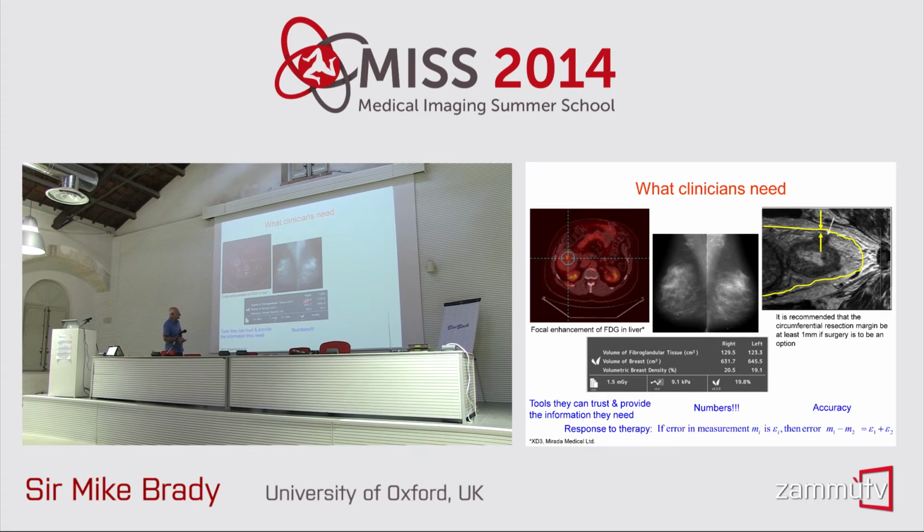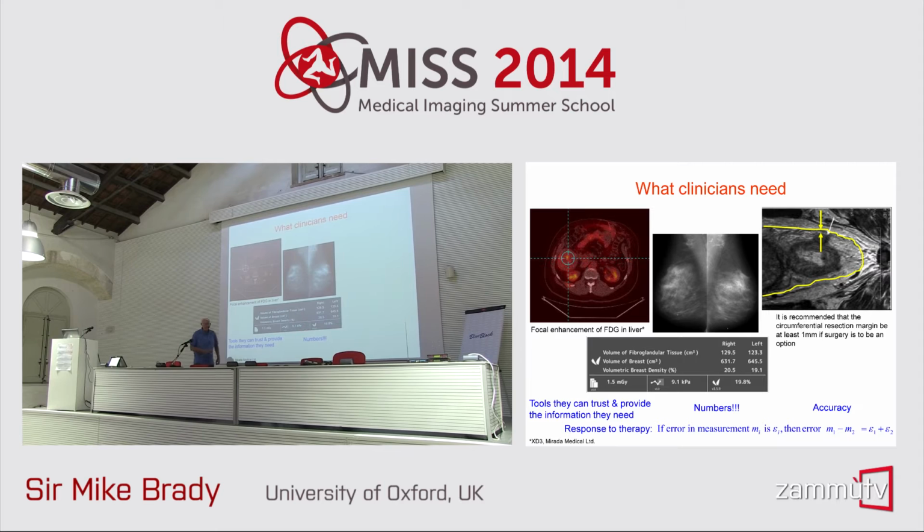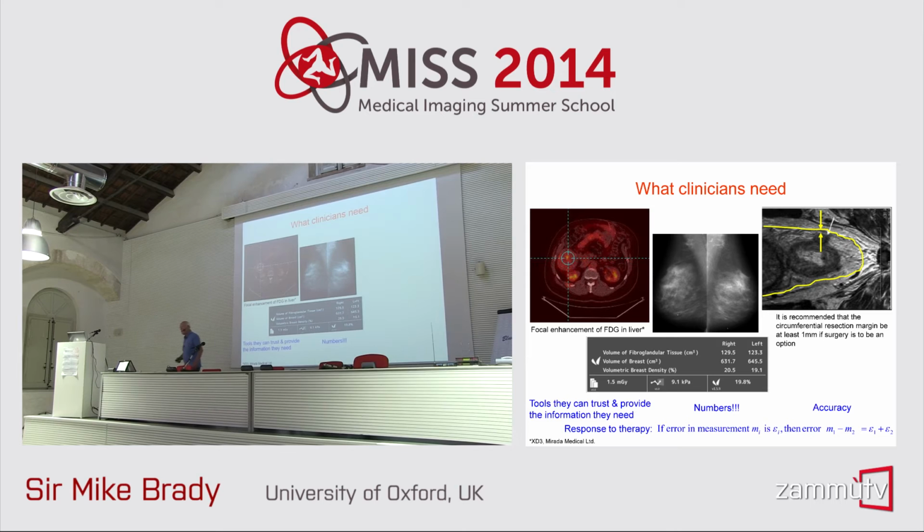Down here, it tells you in milligray the amount of dose of x-rays that went to that particular breast. Here is the pressure in kilopascals that were applied between the compression plates and so forth. Those are the numbers that doctors need, and I'm going to come back to that a little bit later.